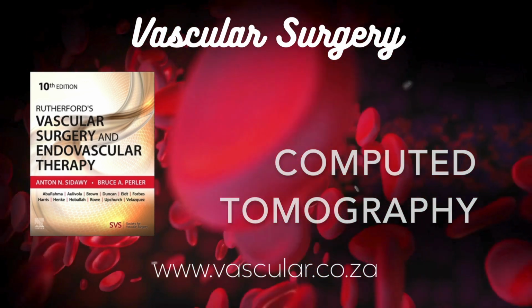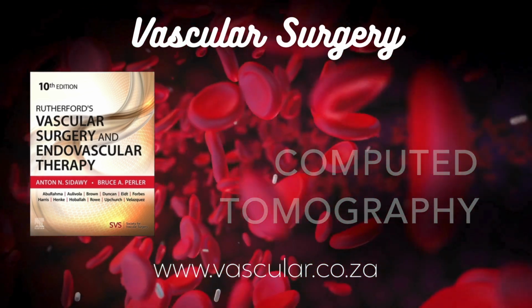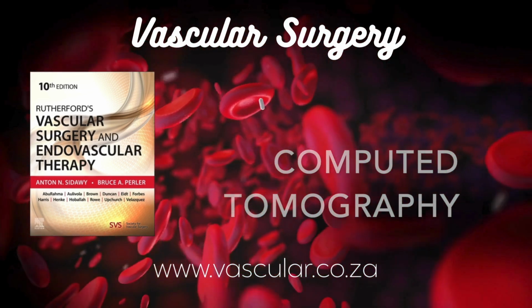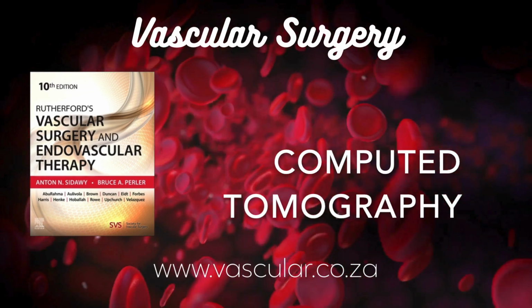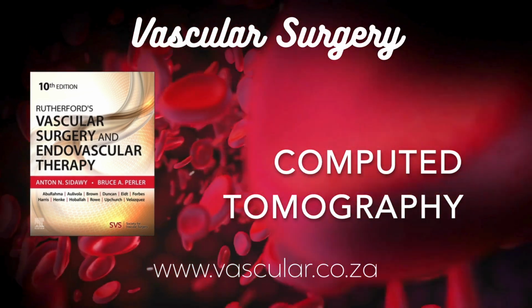What about length? Length is harder, especially in curvy vessels. You can try drawing a line along the vessel on MPRs, but it's not always precise. There's also curvilinear reformatting, which tries to straighten out the vessel electronically. Does that work well? It helps visualize the whole length, but it can distort angles and isn't always perfect for precise length measurement, especially for things like planning stent graft lengths.